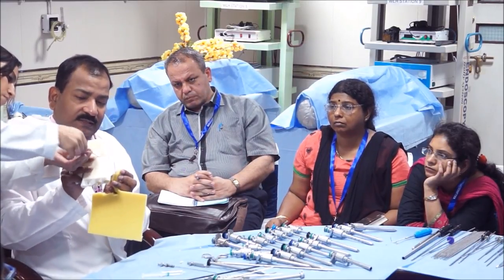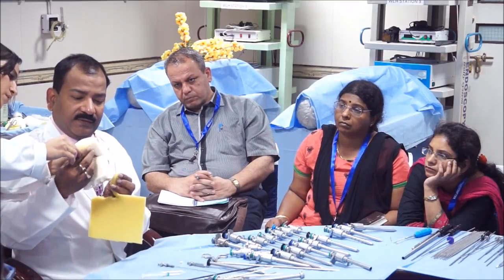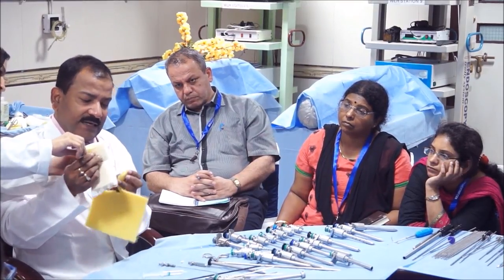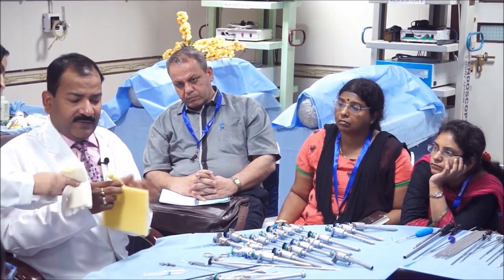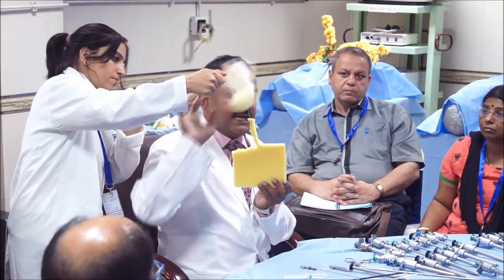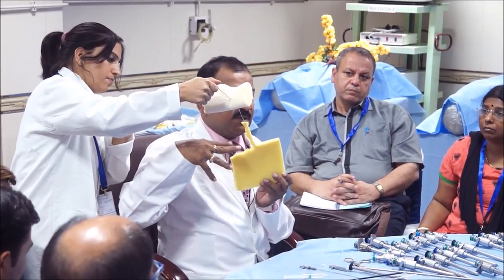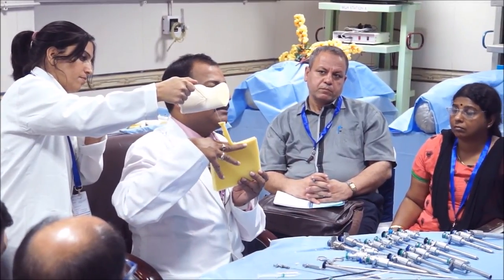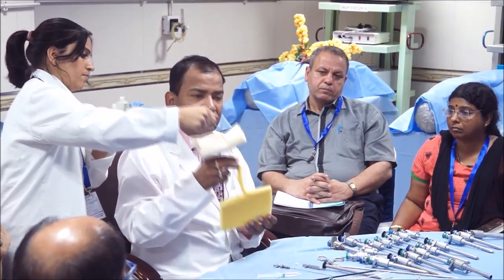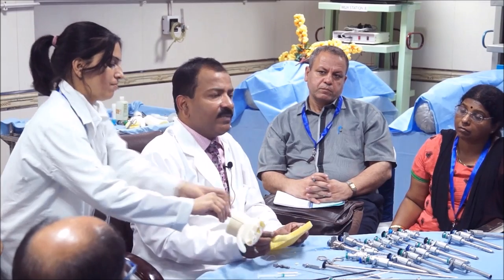Press a little. Very good. Leave it. And then once this goes, it will act as a traction. See here, the suture itself is giving traction. And then with another grasper or harmonic, you can dissect the meso-appendix and you can separate it. Okay? So this way it can be used for other purposes also.